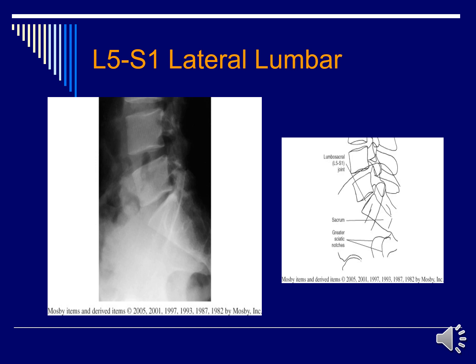When you're doing this, you can collimate down to about a 4x4 just to make sure that you're getting that L5-S1 area. That's all we're interested in seeing is that joint space there. You want to make sure that that joint space is open, so you may or may not need to have a 5 to 8 degree caudal angle. Once again, look at your spine to determine if you need that to keep that space open. This one is with support.